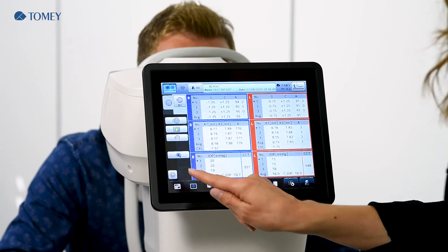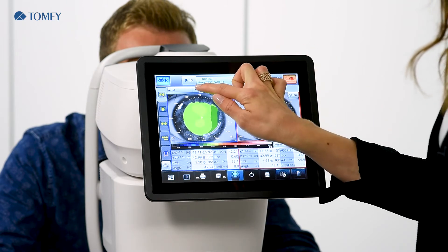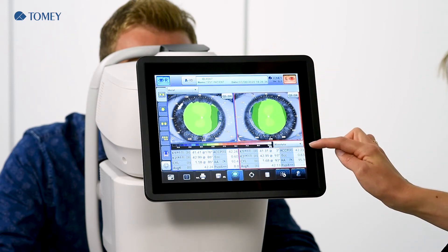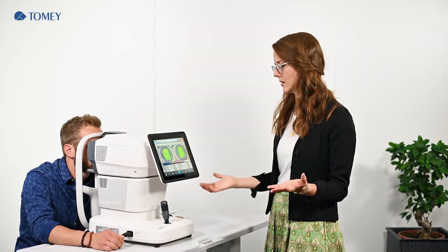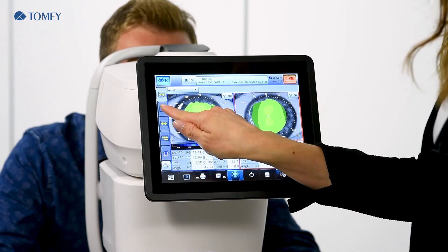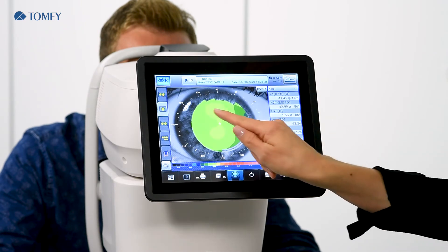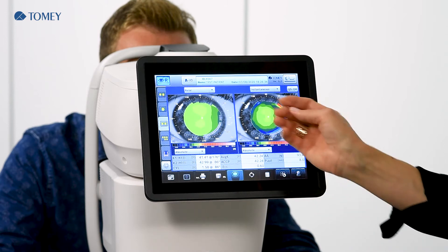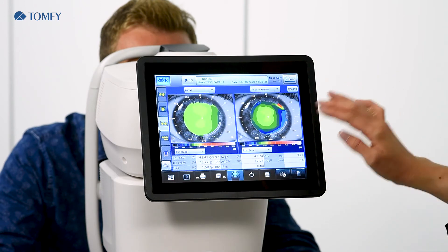Now we go on in the analysis with the topography. In the first screen of the topography you can see the right eye and the left eye at the same time. Here you have the possibility to choose between map types, for example axial or instantaneous, and also the possibility to have different color scales which you can adjust as you prefer. The next map is a single map where you can see either the left eye or the right eye in a bigger screen. We also have the possibility to compare different map types on the same eye — for example the right eye with the axial map and the instantaneous map side by side.